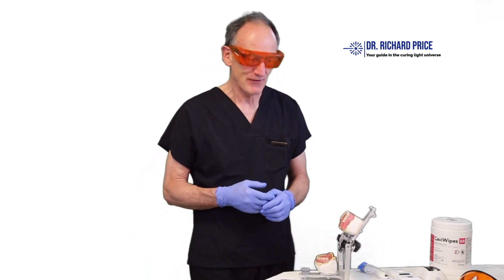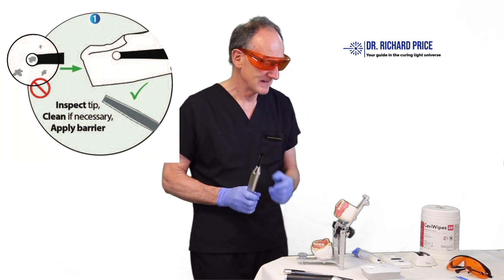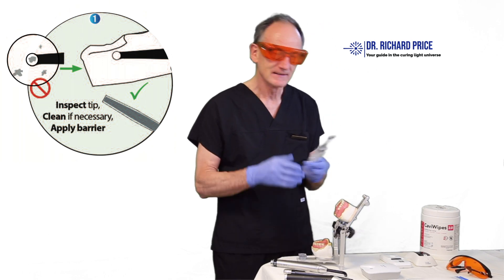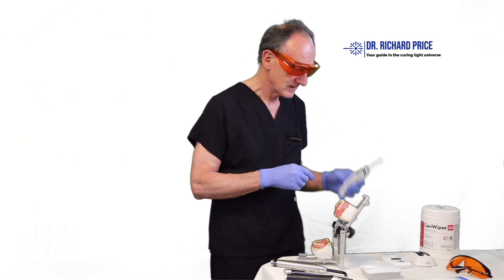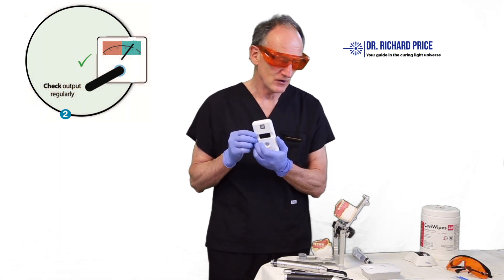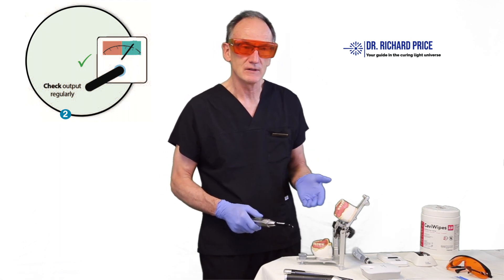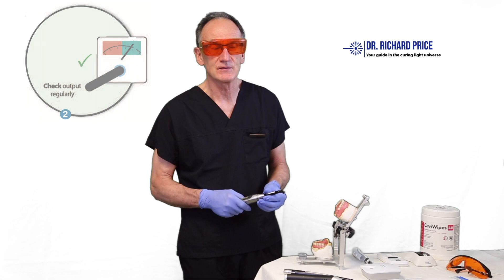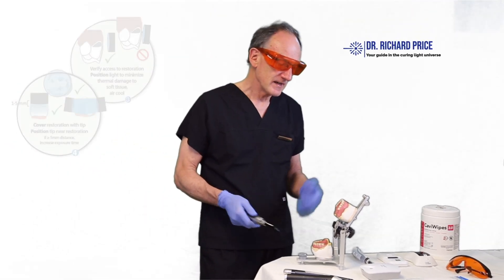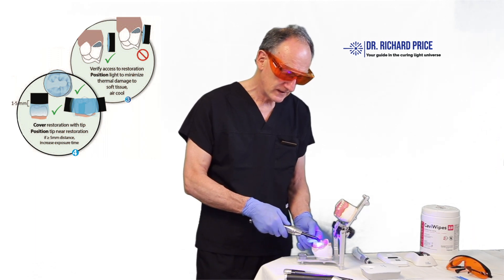Here are some quick tips on light curing. First, make sure the tip of the curing light isn't damaged or covered in debris. Next, apply a barrier sleeve and make sure it's smooth with no wrinkles over the tip. Check the output of the curing light with a radiometer on a fairly regular basis — at least once a day — because there's nothing worse than finishing a whole day only to find the light wasn't working properly.